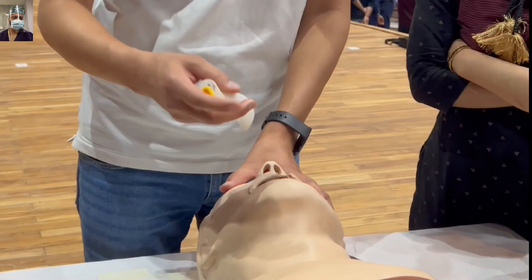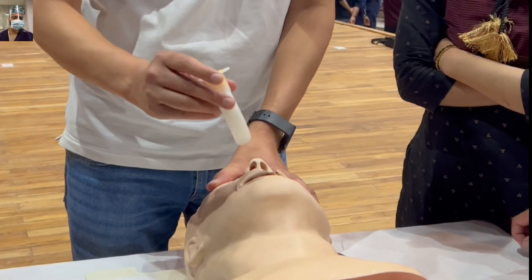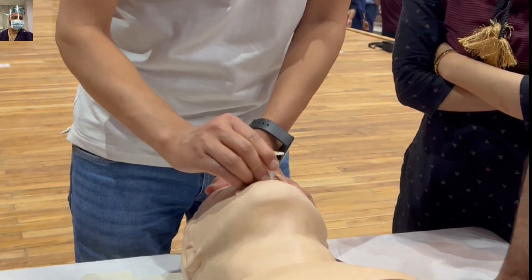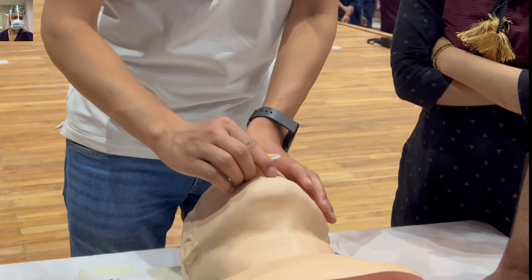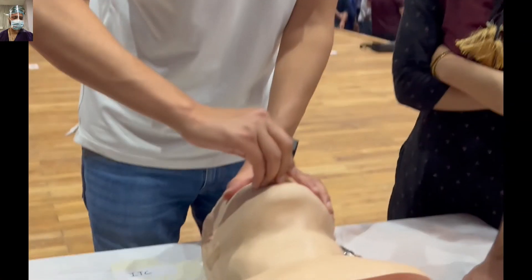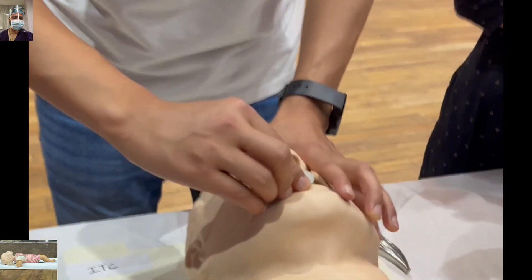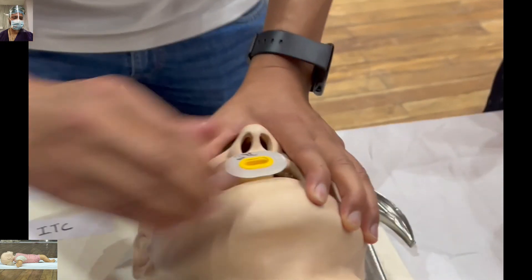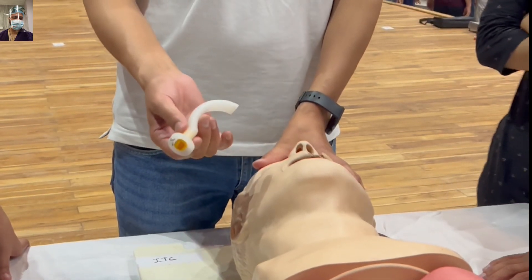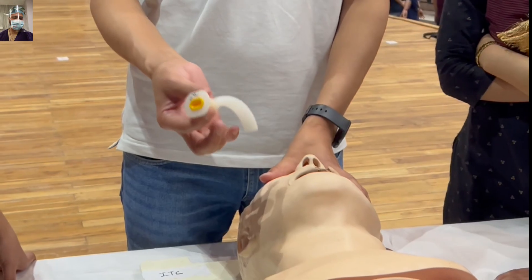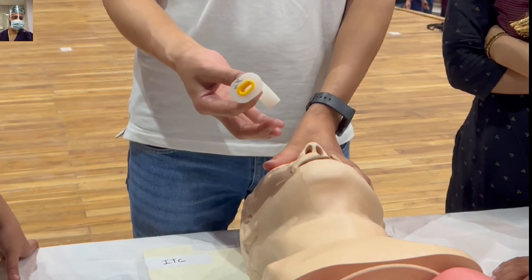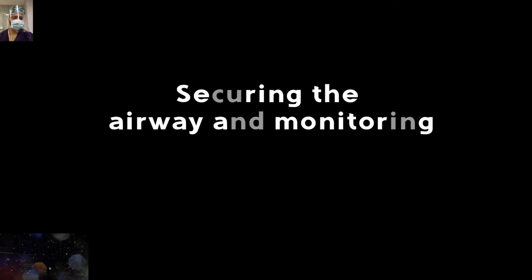Standing at the head end of the patient, hold the Guedel's Airway with the tip pointing upward toward you. Insert it into the mouth, and once it has passed the tongue, rotate the entire Guedel's Airway by 180 degrees, as being demonstrated in this video. After rotating, secure the airway — you can tie it or fix it with tape — and then begin ventilating the patient.